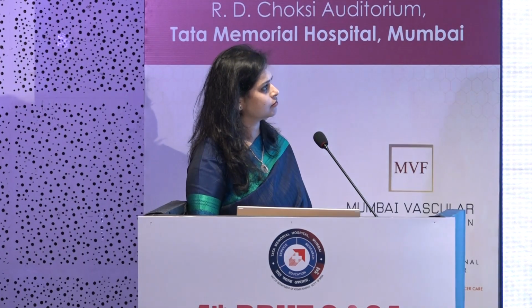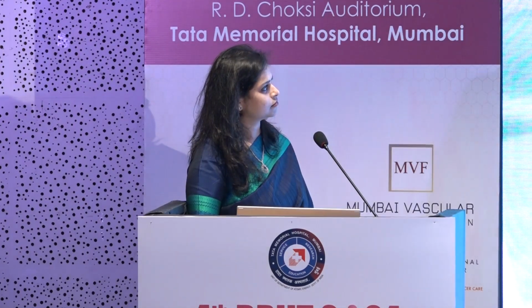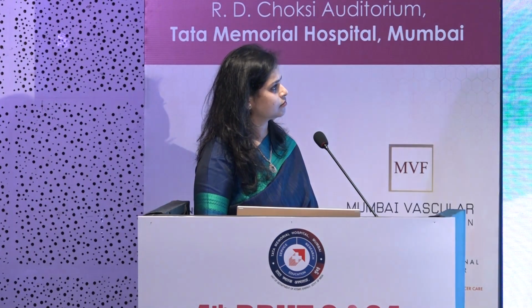So now we will take local anesthesia. One thing that we always keep handy: in this patient we have to go in 6.3 centimeters. Hence, the depth penetration is not going to be sufficient with a usual needle. For that reason, it is always helpful to pre-plan and always have a spinal needle available so that whenever an axis or an approach is changed, we have the depth penetration covered. So here I will give local with a spinal needle.